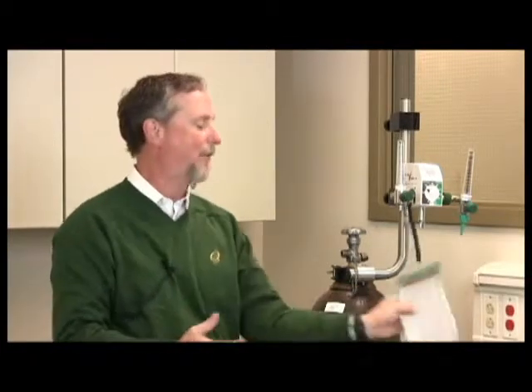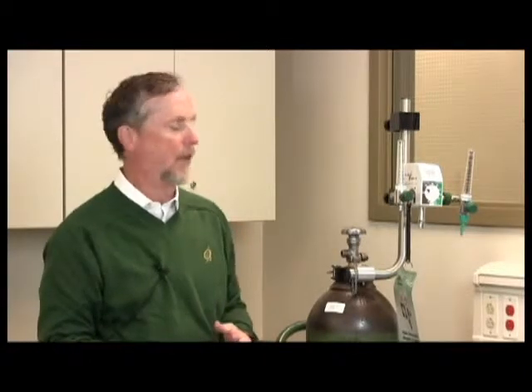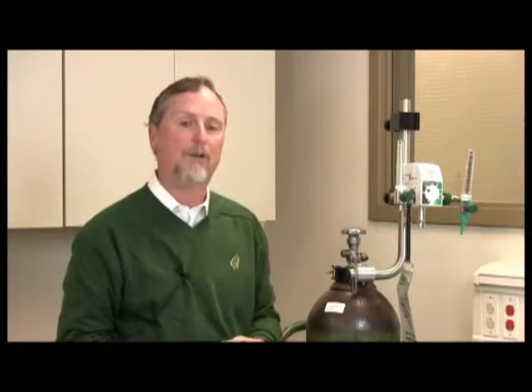This low flow Heliox blender is an 80-20 blender, and it is rated for 0 to 30 liters a minute of oxygen flow, but with Heliox flow and with the 80-20 concentration, we can get a maximum of about 54 liters per minute through this blender. So a low flow blender is really good to use in terms of dealing with patients non-invasively: the masks, nasal cannulas, doing aerosol treatment, those types of things. So the low flow Heliox blender is really the choice for a lot of different applications. A high flow blender is used when you need much more than 54 liters of flow. But like I said, for most applications, the low flow blender is good for Heliox.